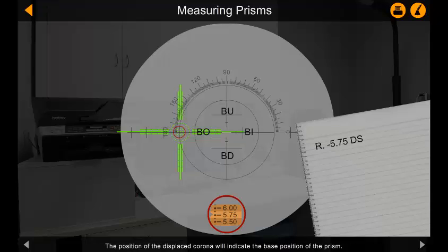The position of the displaced corona will indicate the base position of the prism. In this example we are using a base out prism with the right eye lens, hence the green corona is displaced outwards.